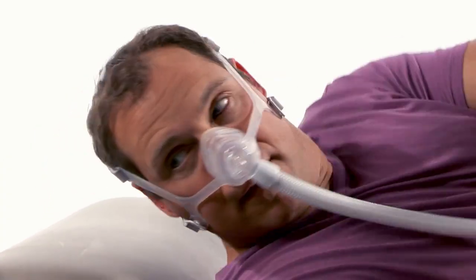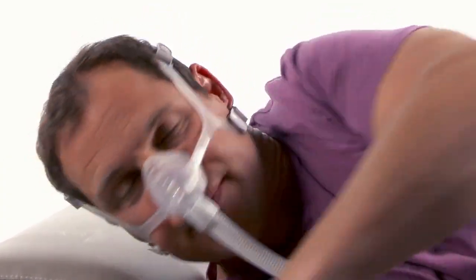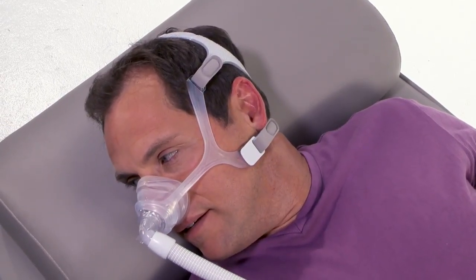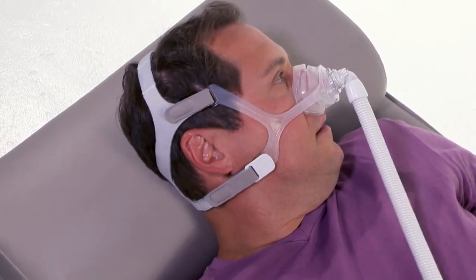Turn on the air flow and lie down. With your therapy pressure at the prescribed level, breathe normally through your nose and turn your head from side to side to identify any leaks that may interfere with sleep.